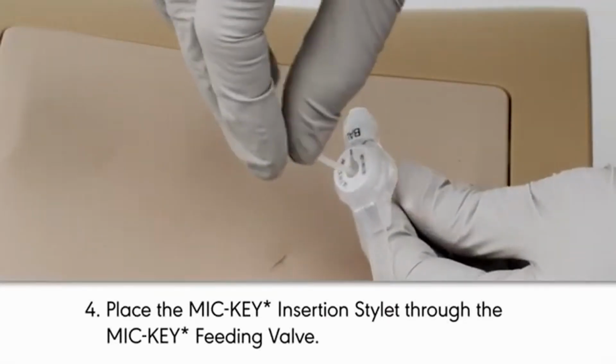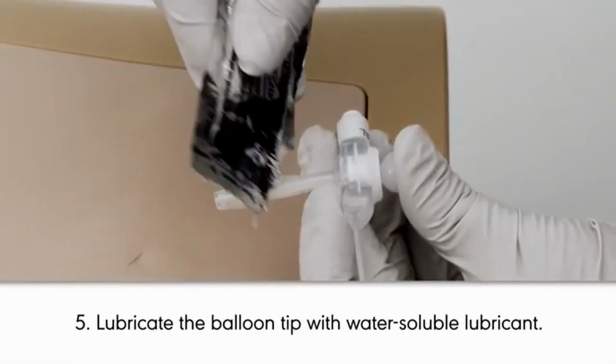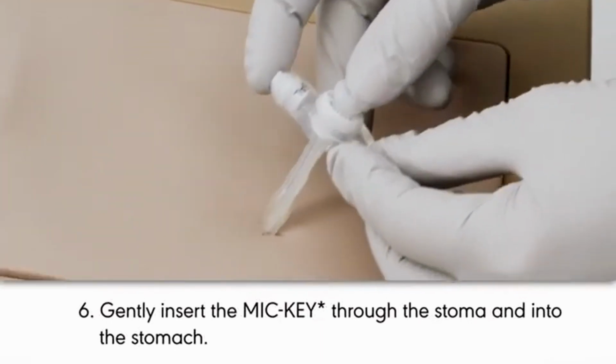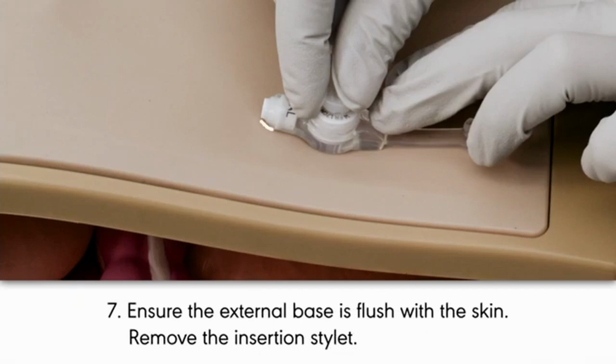Place the MIC KEY insertion stylet through the MIC KEY feeding valve. Lubricate the balloon tip with water-soluble lubricant and gently insert the MIC KEY through the stoma and into the stomach. Ensure the external base is flush with the skin.